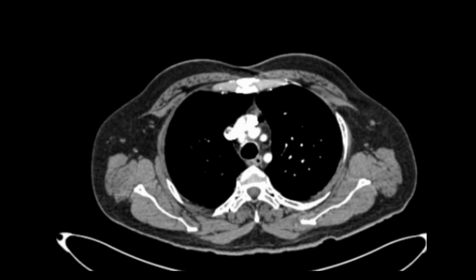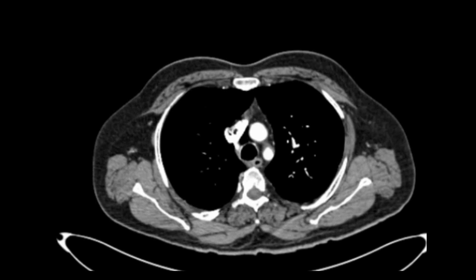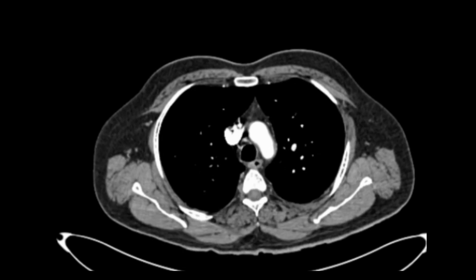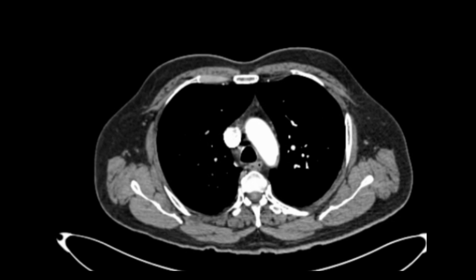The carotid branches end and now we can see the arch of the aorta. Here is the SVC and the trachea.